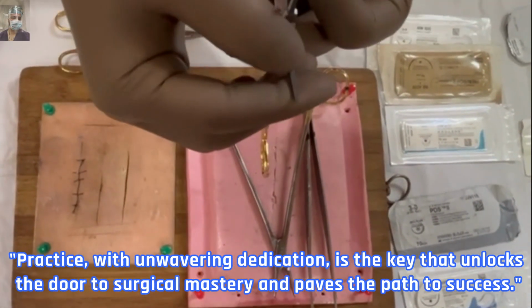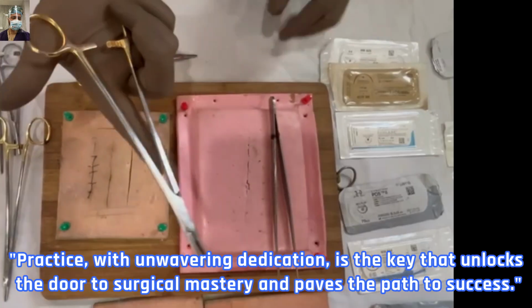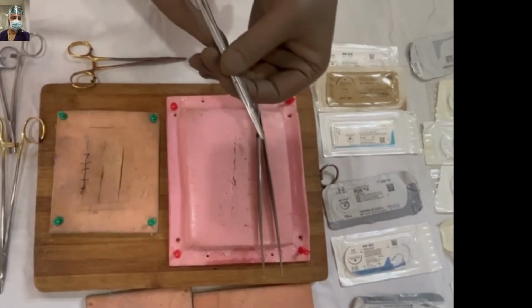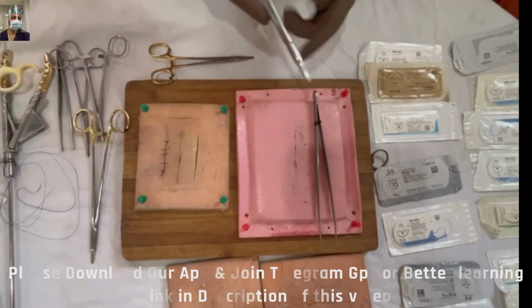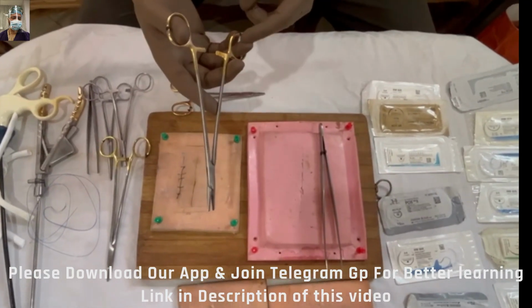These are long and short golden handle needle holders. They are lighter weight and the control is better. So it is not essential to buy them in the beginning. You can buy them if needed as you go along the journey.